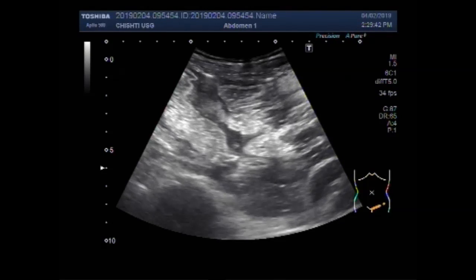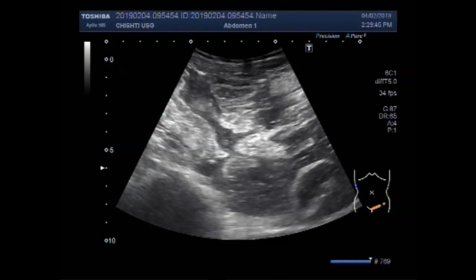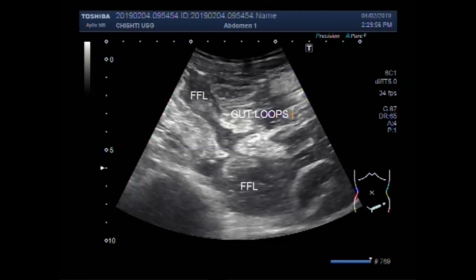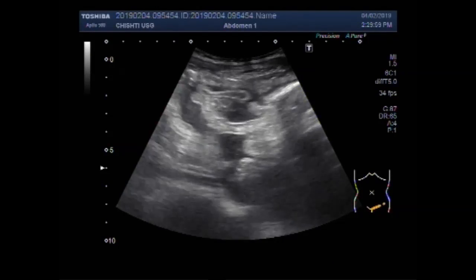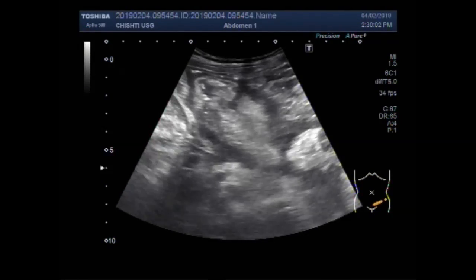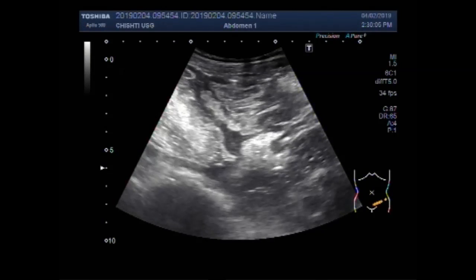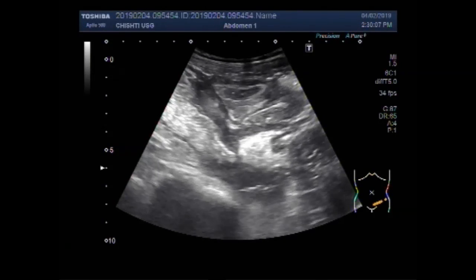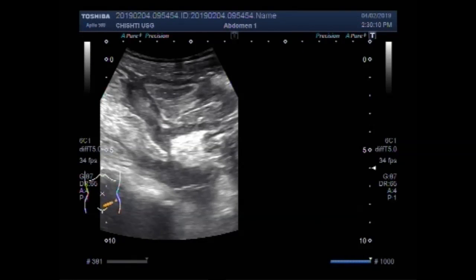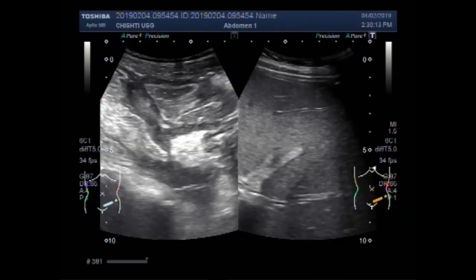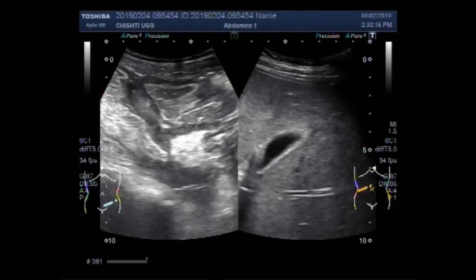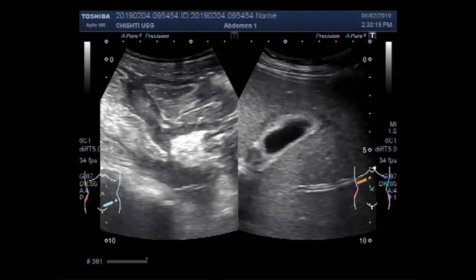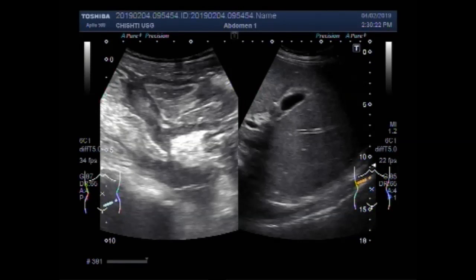These are the gut loops in the lower abdominal cavity and the left side of the abdomen. This is free fluid, and these are the gut loops. Now this is the liver and thick-walled gallbladder.